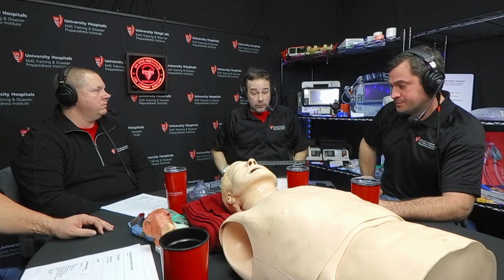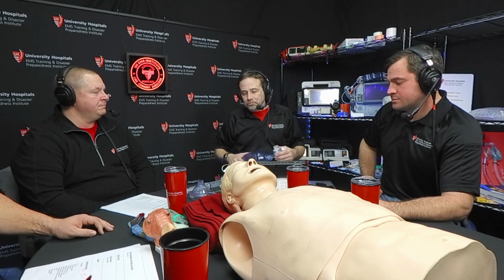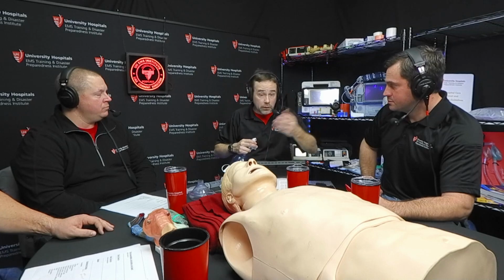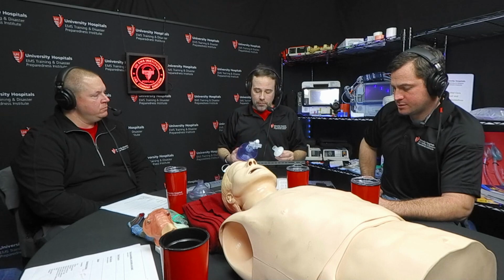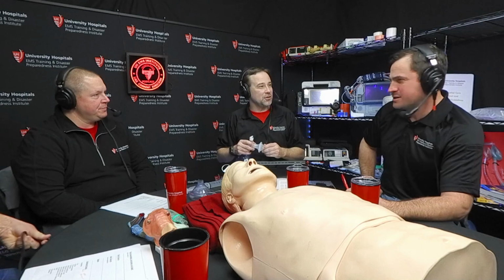They're failing to oxygenate because of whatever their disease process is, so we may add it to begin with. And talk about underutilized, it's almost non-existent. I'm kind of on an island here talking about this, in Northeast Ohio. We just don't utilize that very simple tool. And we don't carry surfactant in the squads. They do for neonates, I believe. They get it when premature, but they can make it at the hospital. They don't have it in the truck.